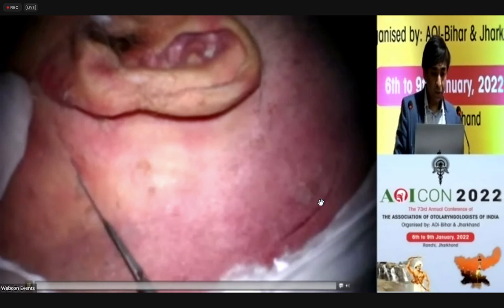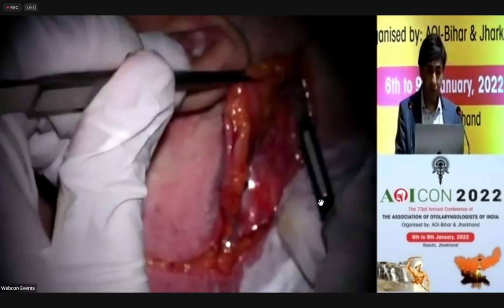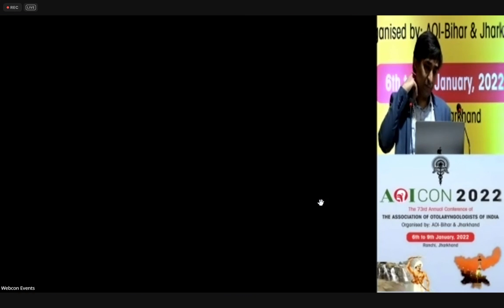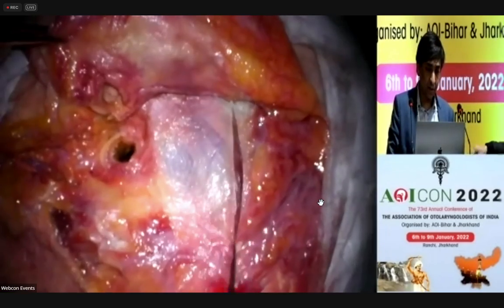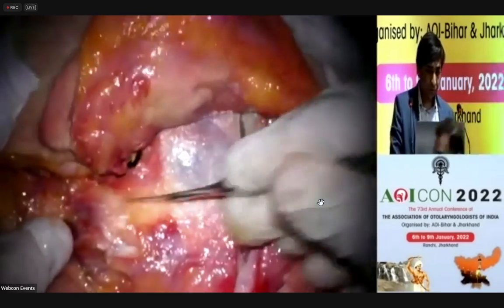Okay, so this is an anatomical video of an infratemporal fossa approach. You see that the skin flaps are elevated in two planes. One is skin and subcutaneous, and the lower one is a temporoparietal fascia flap. So the temporalis muscle and all the fascia come into the second layer. Here we do a blind sac closure, obviously, in all cases. A T flap is elevated.